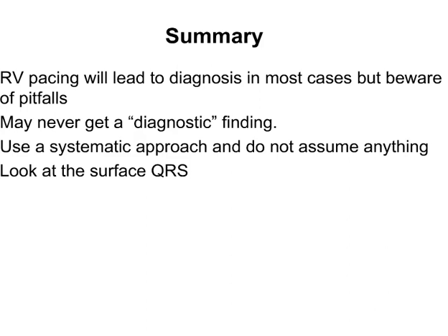There are some tricks. I'm not sure there's a number of extra stimuli. We use this Michigan protocol where you put up to 4 extra stimuli, frequently even in the atrium. But I fuss a lot. I know that some of these people have AV node reentry and I want a better endpoint, and it can take a lot of fussing. Isoproterenol on and off, different autonomic states, give a little atropine, burst pace very rapidly, wait for the effect to wear off because you can't get any block in the AV node.